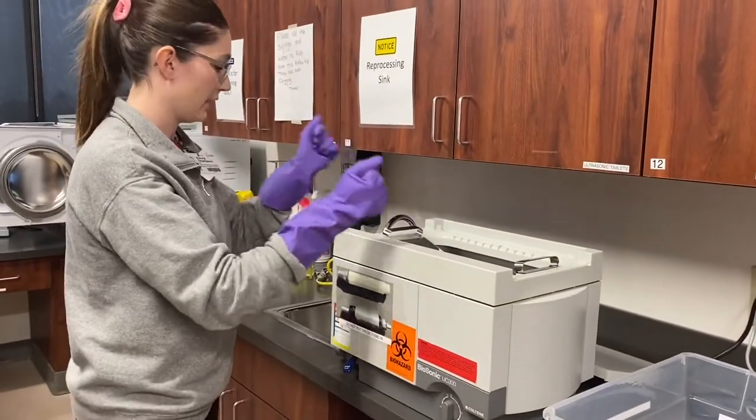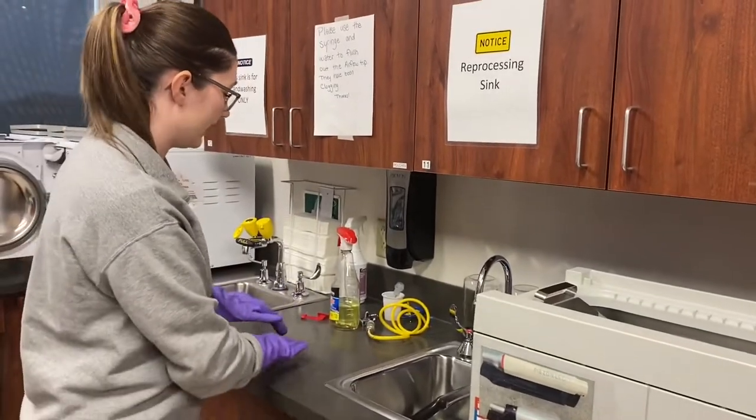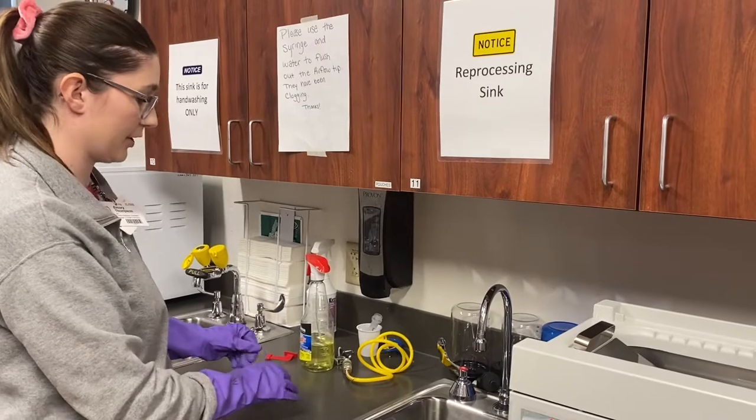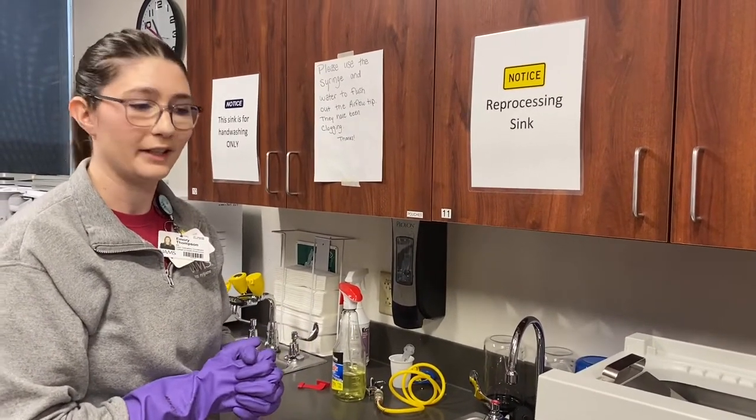Whenever they're all finished you take it in here and rinse this off really well, and then you will dry off the instruments with the towels that are here. There are a few instruments that need special care and we'll go over that in another video.